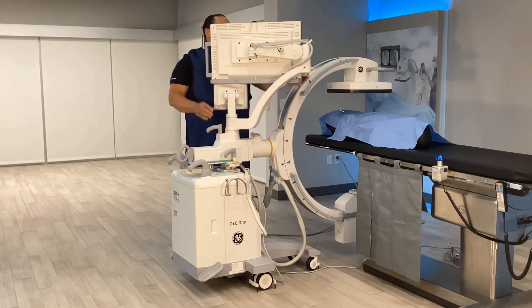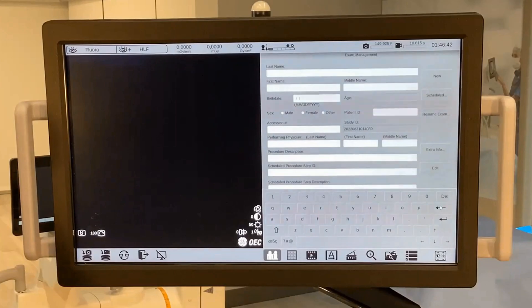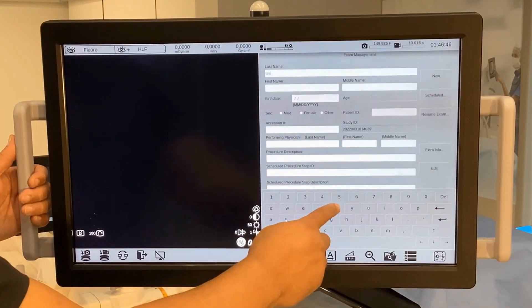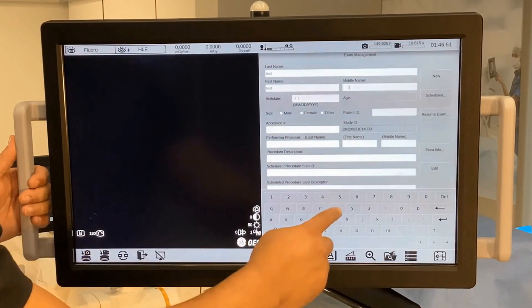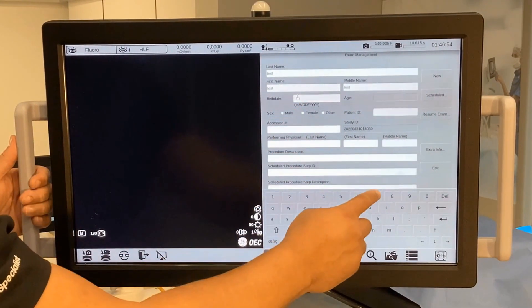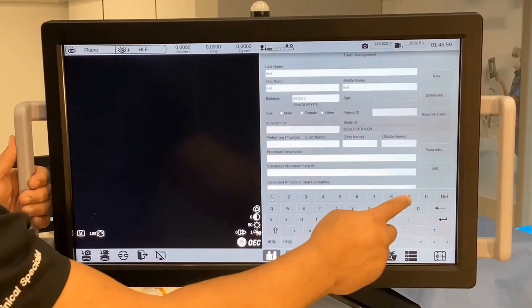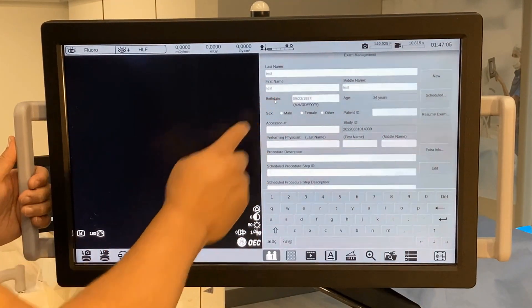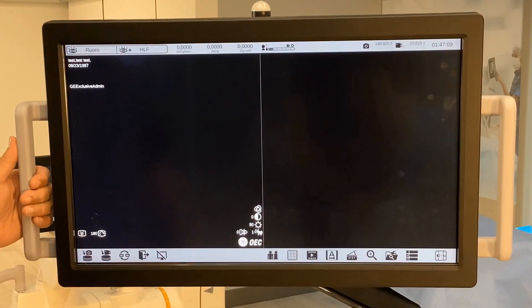Move the monitor arm to access the screen to enter patient information. To manually enter patient information, utilize the virtual keyboard. If the keyboard does not appear, touch the field that you would like to enter the information in. Type in the patient information in the open fields. Touching a gray area will make the keyboard disappear. Press the exit button once complete.